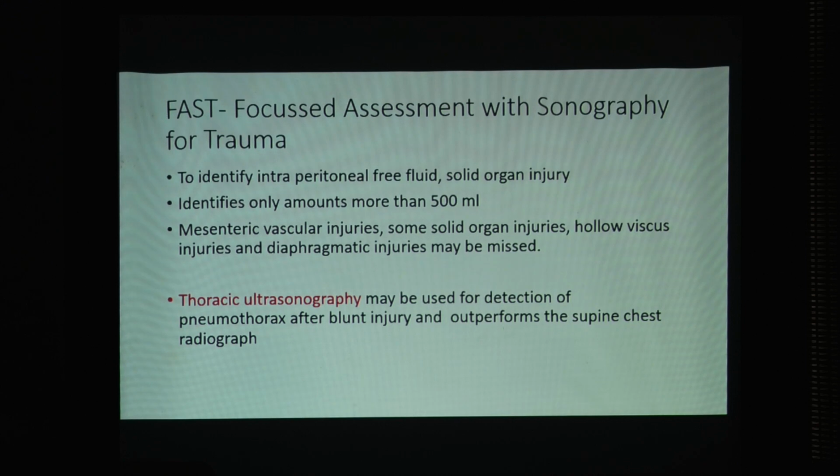Then FAST is focused assessment with sonography for trauma. You can mainly identify intraperitoneal fluid and solid organ injury, but the problem is it identifies only amounts more than 500 ml. Mesenteric vascular injuries, solid organ injuries, hollow viscus injuries, diaphragmatic injuries, etc. may be missed.